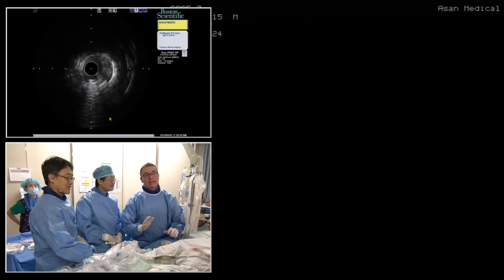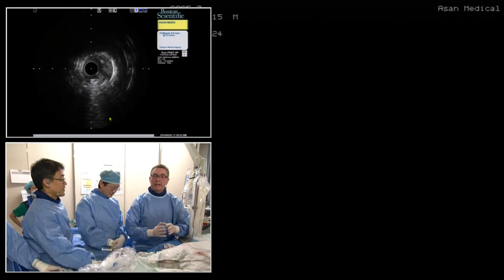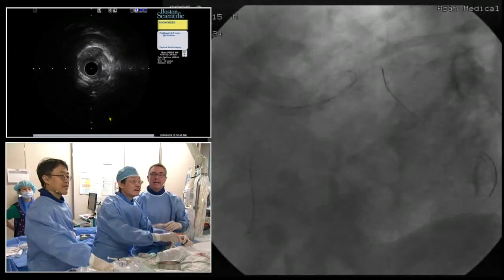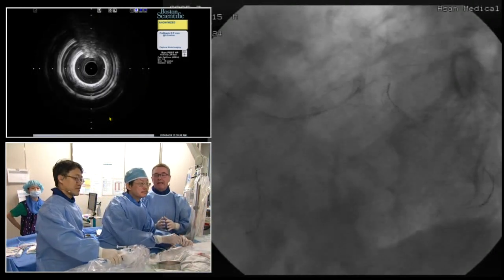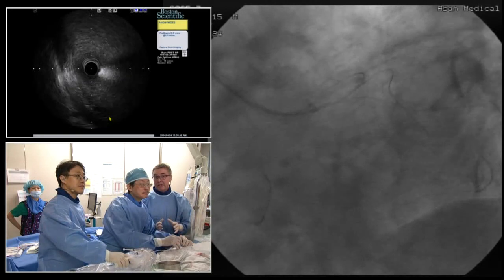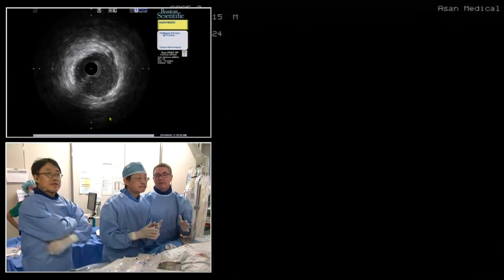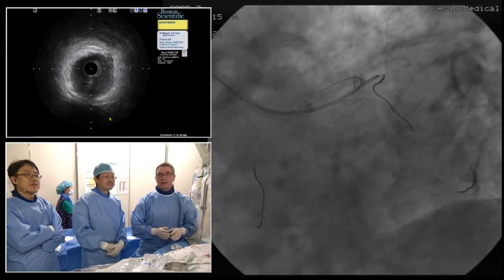Okay, well, look, I think it's a soft plaque, concentric plaque. With these ones where you've got a significant size mismatch between the LAD and the left main, I think size the stent on the ideal position in the left main and use a proximal optimization technique. I think this is a very handy addition. And with these modern stents, all of the modern stents are just so good. Okay, actually, let's look at the size.